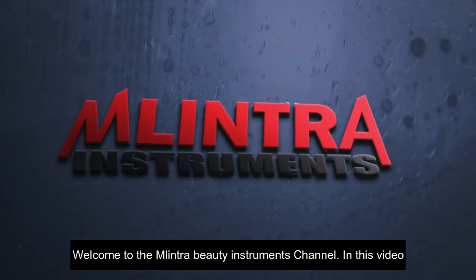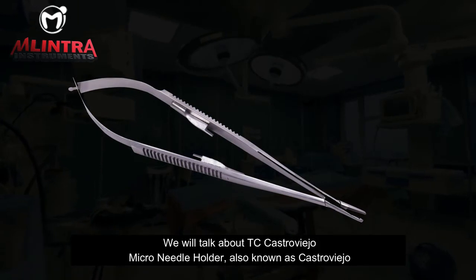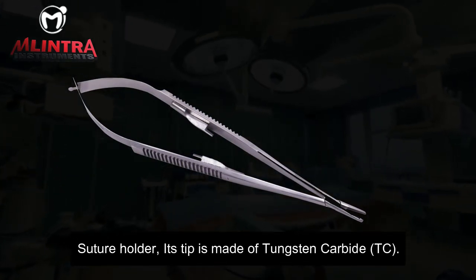Welcome to the Mlintra Beauty Instruments channel. In this video, we will talk about the TC Castroviejo Micro Needle Holder, also known as the Castroviejo Suture Holder.